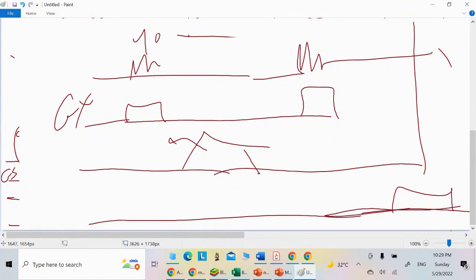So why do I keep the phase encoding on only briefly while I turn the frequency encoding gradient on and off? The reason is that if you apply frequency encoding together with phase encoding, both gradients will be in opposite directions. And what will happen, doctor? They will cancel each other out. Therefore, you cannot continuously apply both. You only do it during the pulse signal and then revert it back.